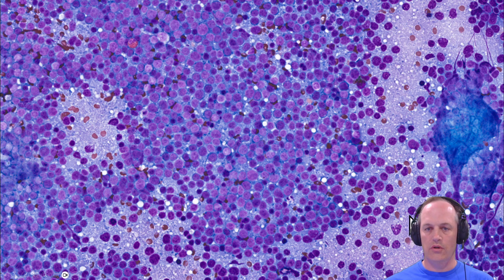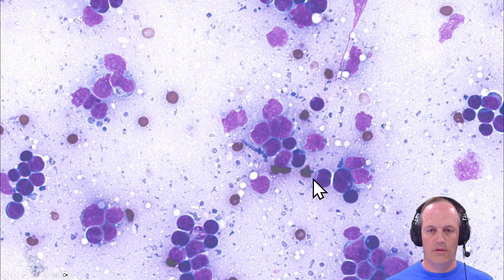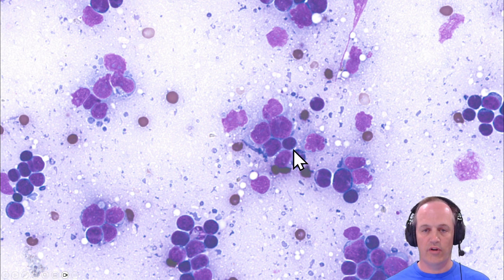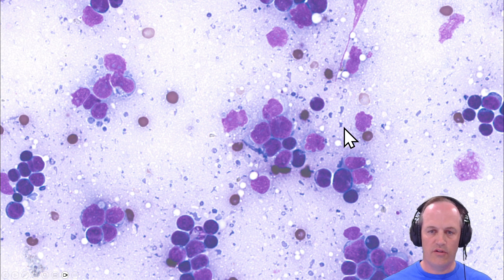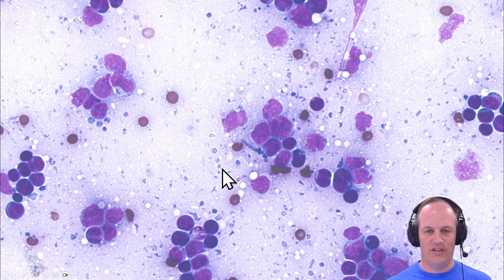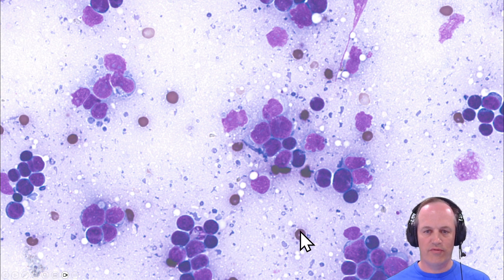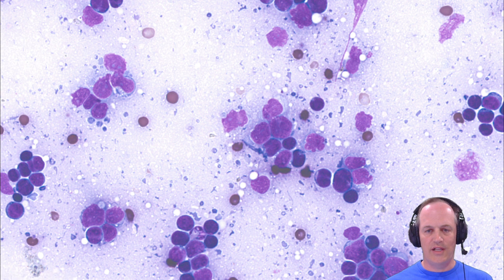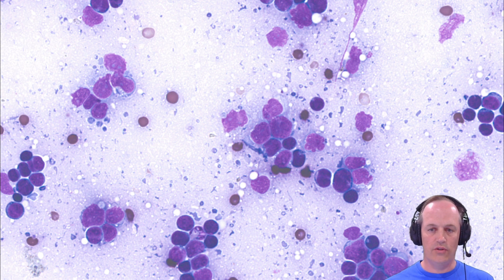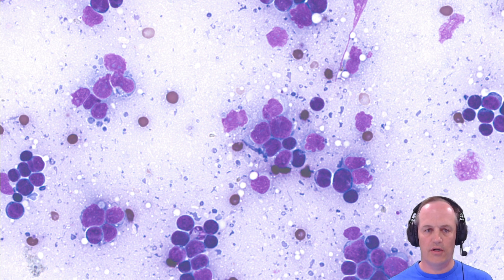As you get to higher power, the other thing you'll see are all these little cell fragments in the background. The cells themselves have a really high nucleus-to-cytoplasm ratio - very scant, very pale, very blue cytoplasm on this touch prep. Do you see all these little fragments in the background? They're fragments of cytoplasm that break off of these lymphoid cells in a touch prep. These are called lymphoglandular bodies. This is a great clue that you're looking at lymphoma. If you see something that's discohesive, not making three-dimensional clusters, and it's dropping lymphoglandular bodies in the background, that's probably lymphoma.